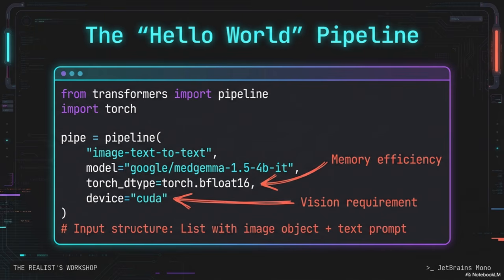So what's the required software stack? You need Python, PyTorch with CUDA support, Transformers version 4.50 or higher. That's required for the Gemma 3 support, and Accelerate. And if you value reproducible results, which you must in this domain, pin those versions. And the canonical model ID to download is Google MedGemma 1.5 4B on Hugging Face. Yeah. That's your starting point. It's the key. And my advice is, if you are aiming for local operation, start small. Get a chest X-ray demo working to stabilize your environment before you even dare tackle the complex volumes.